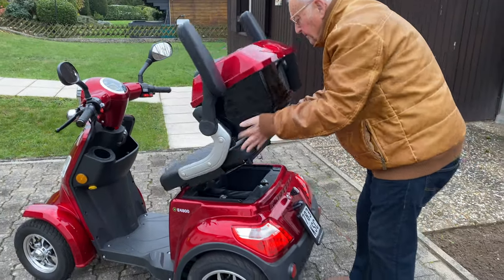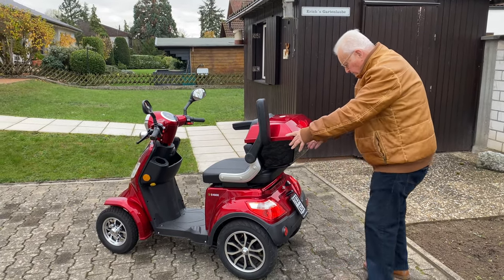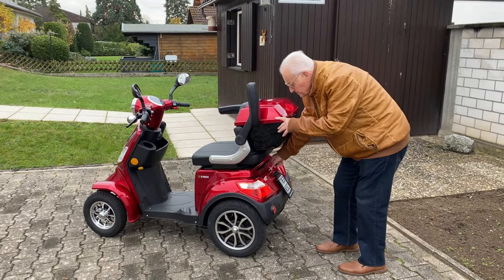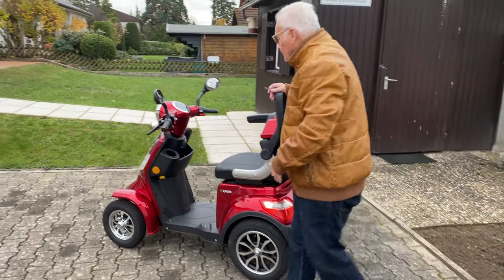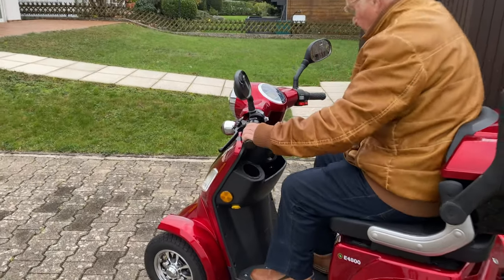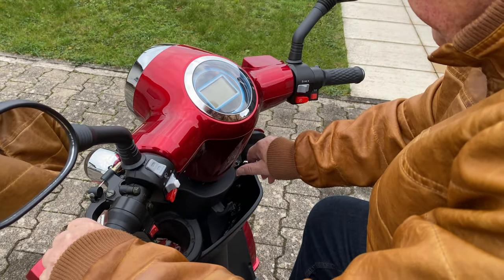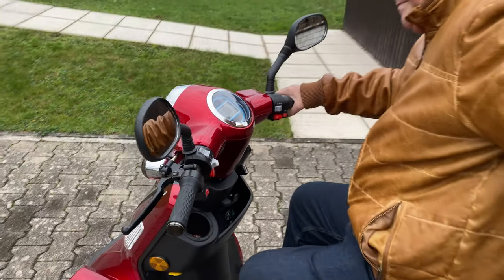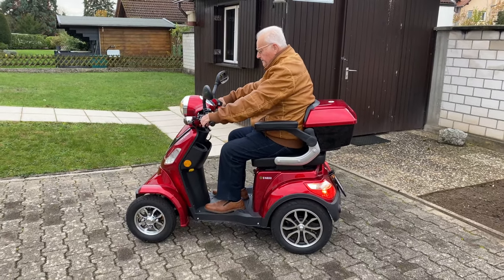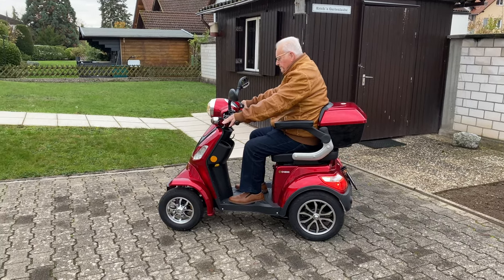You can see my father here at the age of 81 in real driving. He has had his mobility scooter for six months and has now driven about 400 kilometers. So now just sit up, key in the ignition, armrest down, accelerate and let's go!